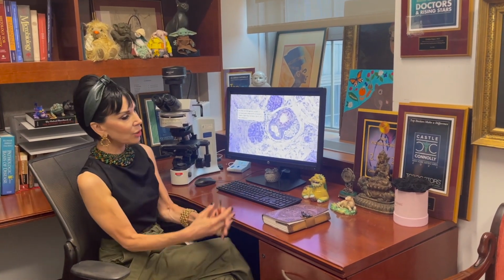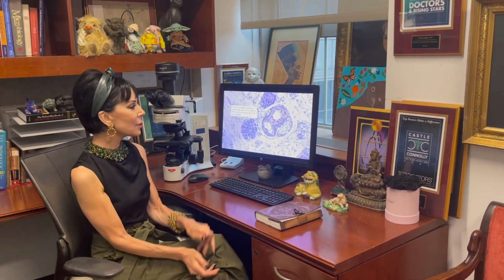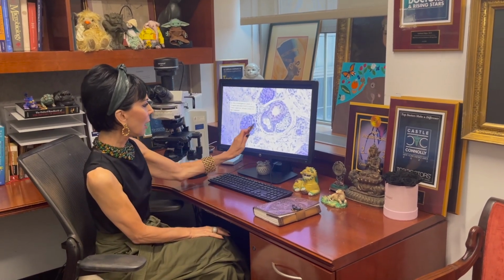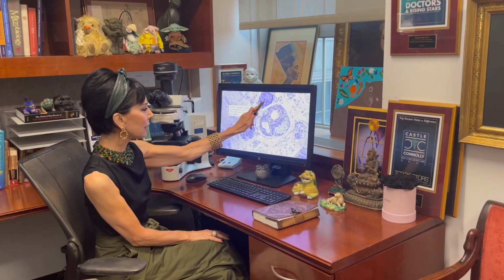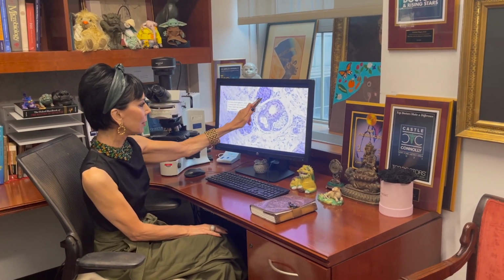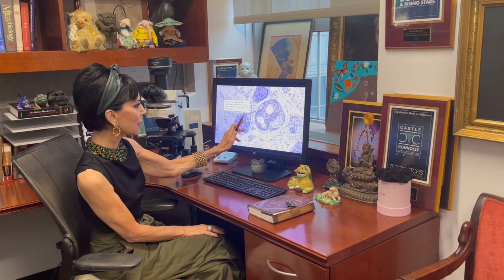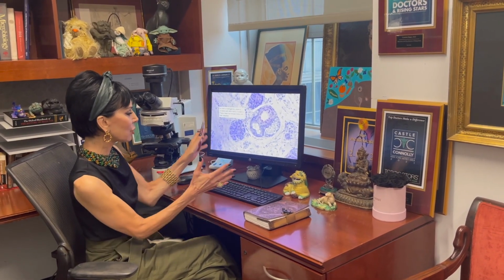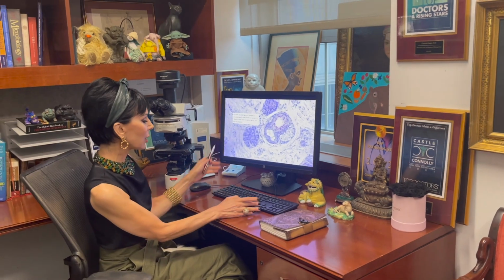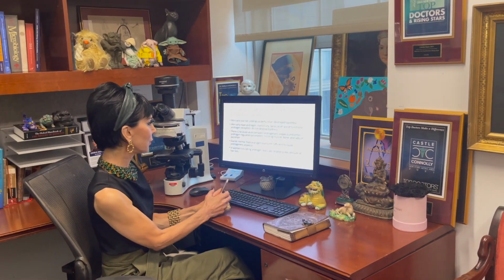At times, androgenetic alopecia does coexist with other types of alopecia, like chronic telogen effluvium and central centrifugal cicatricial alopecia. So in this particular field, we have 3 hairs, and 2 of the hairs are telogen germinal units. So there is both hair miniaturization and involution, and this patient had concurrent androgenetic alopecia and chronic telogen effluvium.